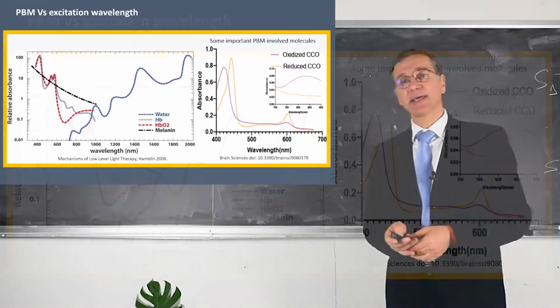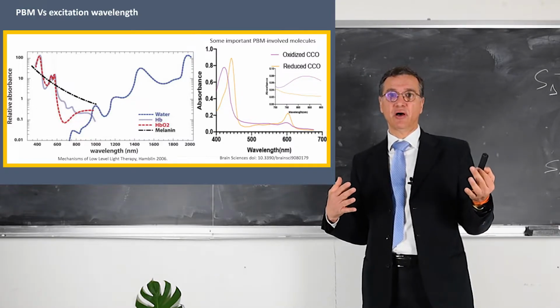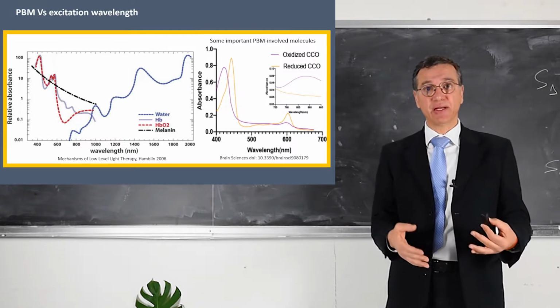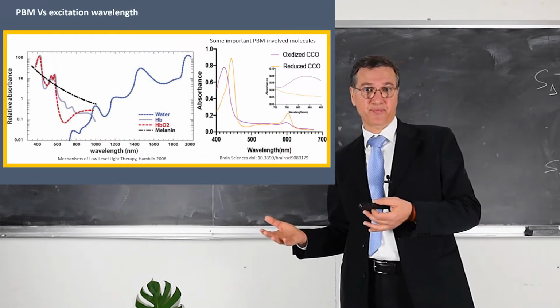In order to understand how effective photobiomodulation is, we have to consider a couple of things. First of all, how deep can I penetrate with light in a tissue? There are two things, absorption and scattering.